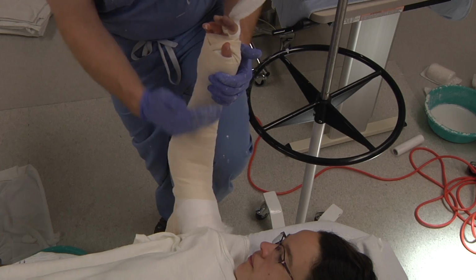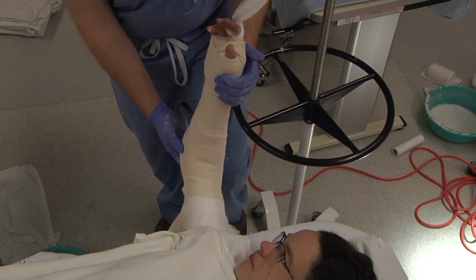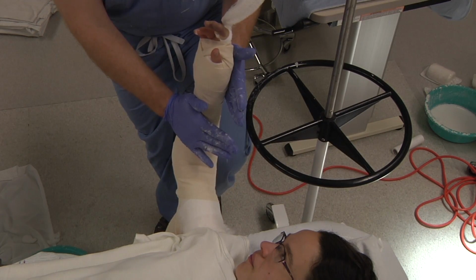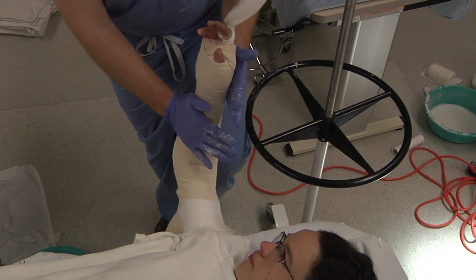Always here, make sure you don't have more than a 90-degree bend at the elbow, kind of 90 degrees, 80 degrees is advisable. Over flexion of the elbow can actually potentially lead to compartment issues or constriction in the setting of a fracture.